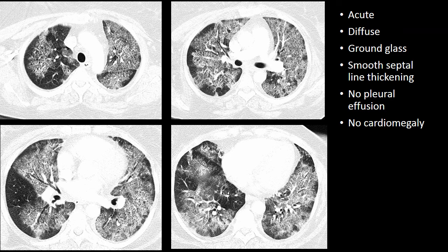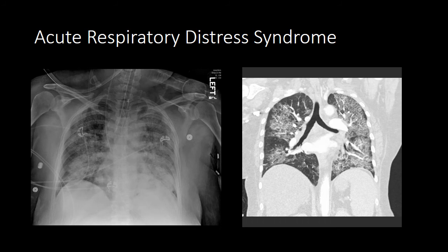This process — just to start introducing some terms — was an acute process. I'm calling it diffuse in terms of its pattern. It has ground glass opacity and smooth septal line thickening, things we'll learn about in future podcasts. We see no pleural effusions and no cardiomegaly. This person had acute respiratory distress syndrome, which is often a diffuse process characterized by non-cardiogenic pulmonary edema.